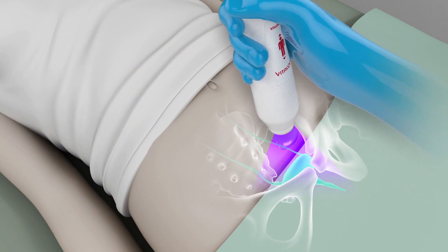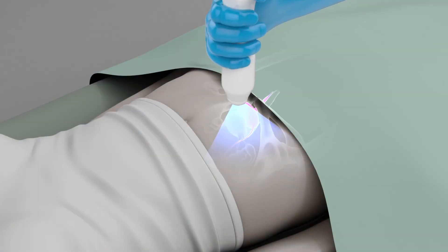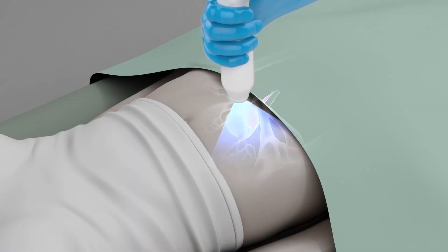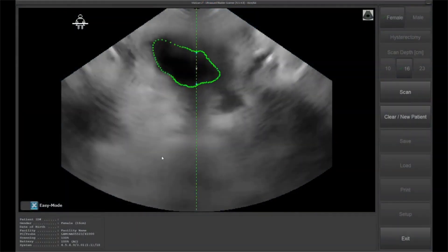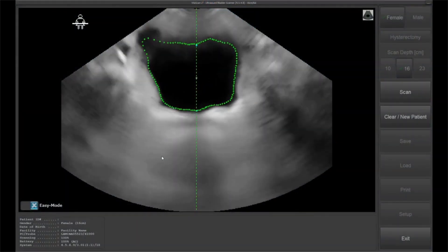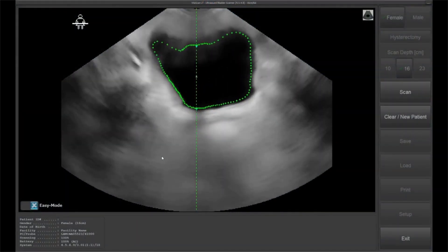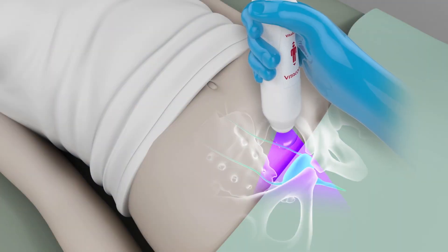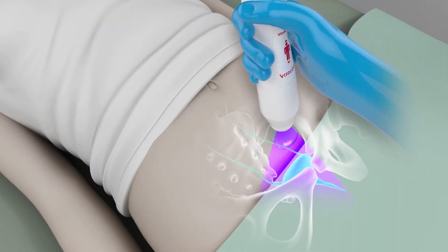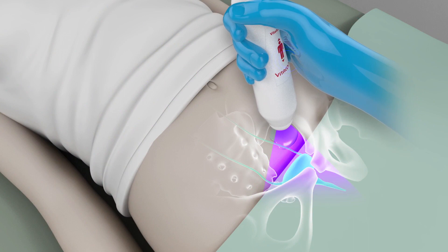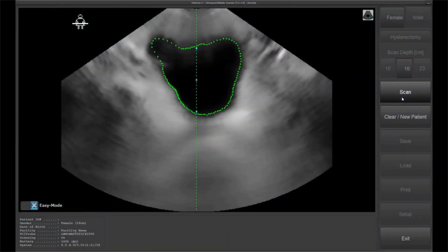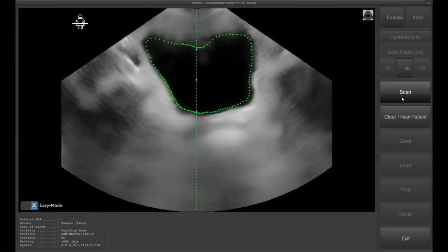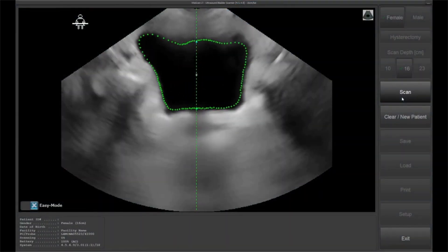Press the scan button to start pre-scan mode. Rock the probe gently and look for a well-defined bladder. Center the bladder in the scanning image. Angle the probe to find the best circumference of the bladder, aiming to target the largest circumference and center the bladder in the display. When this is achieved, press the scan button once more to start the scanning sequence.